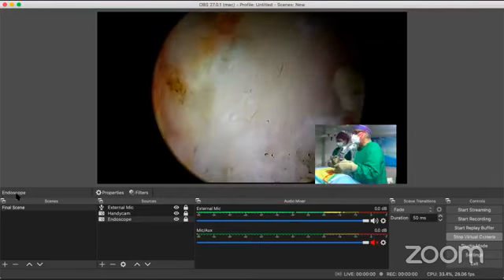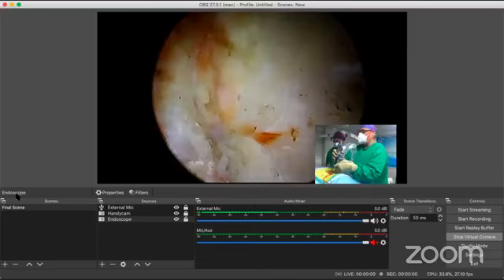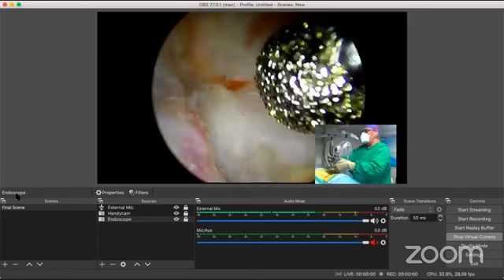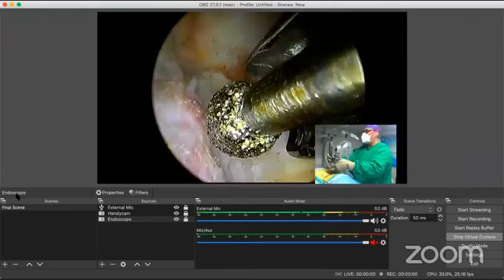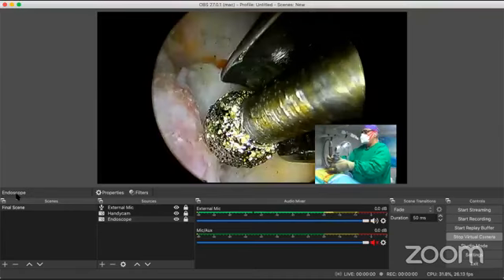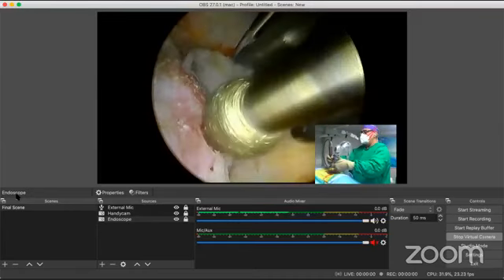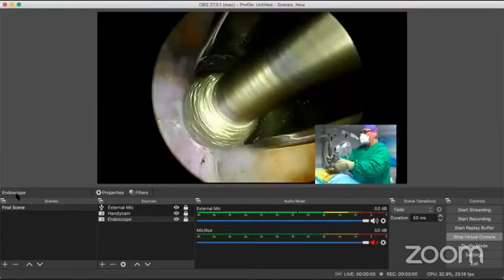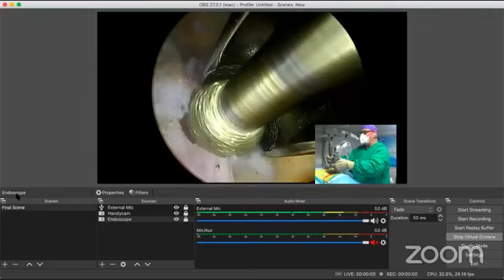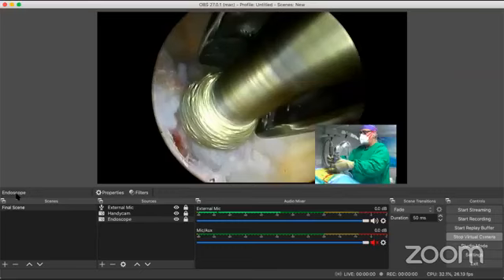Thank you. Okay. Now what I'm going to do, why I'm doing this? Because I don't want to keep on burring the facet without realizing where I'm going to end. So I want to burr only this much. Okay. Burr, please. Okay. Now this is the facetal end point. I don't want to go lateral than this unless I'm sure. I'll tell you why.